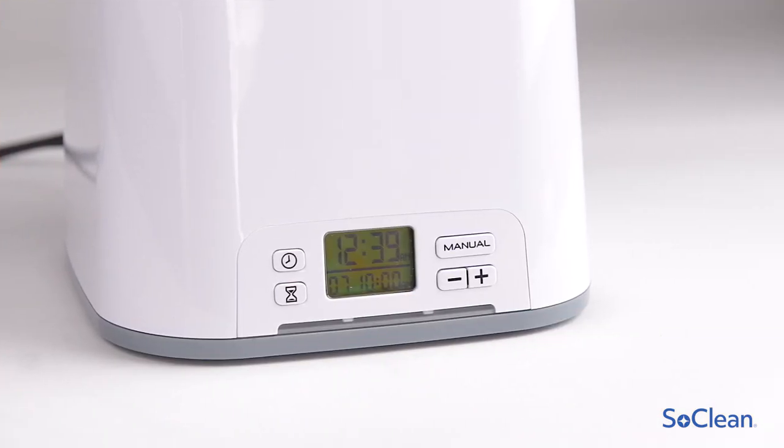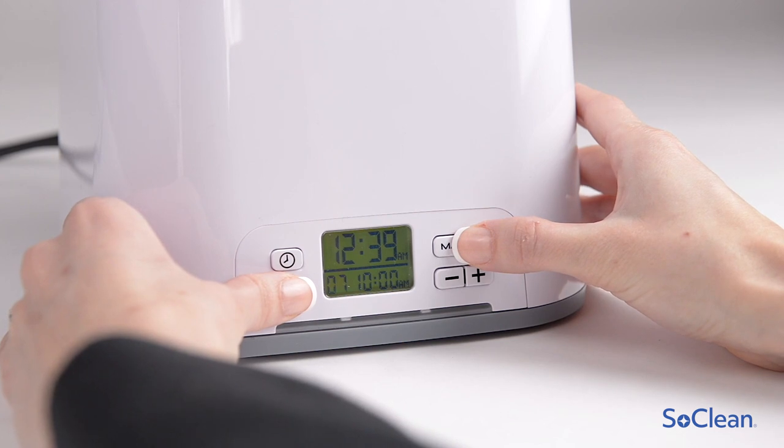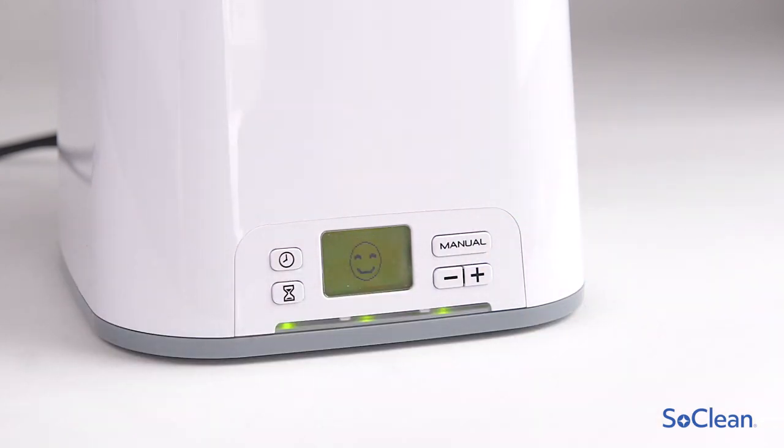Resetting the SoClean should only be done after replacing the cartridge filter and check valve. Press and hold the manual and hourglass buttons simultaneously until you see a smiley face on the display. This means the reset is successful and your SoClean is now ready to use.